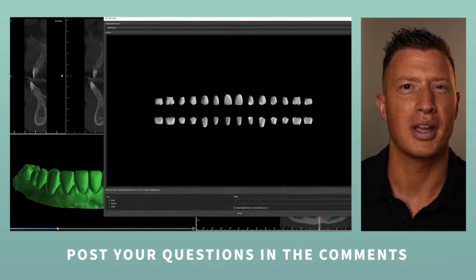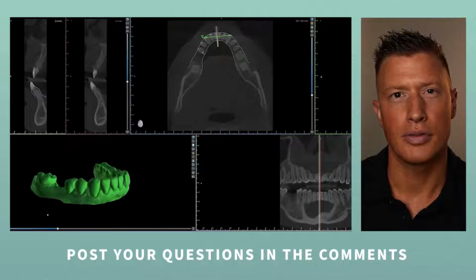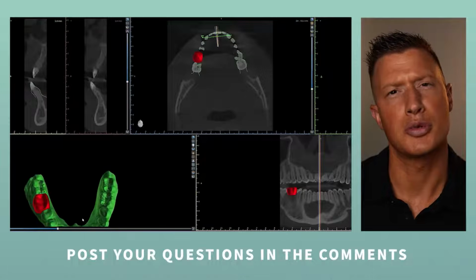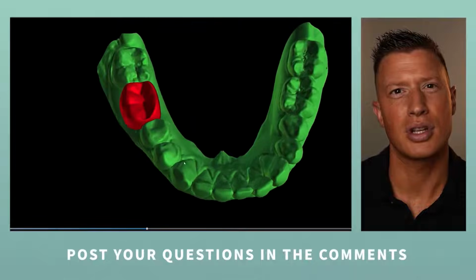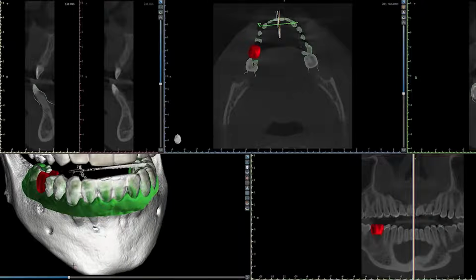And I'm just going through and being extra thorough here. I'm going to put in tooth number 30. I want to design it, and let's see what that tooth shape needs to be. I'm going to move this over there, drop that tooth in, and the tooth is red, obviously. It lets us really see. Very crispy right there, huh? So we're going to move this tooth exactly into the right position. I want to make sure that that position is going to be 100% accurate, and it's going to be allowing me to plan that implant with what is really going to be a tooth that she could chew with.